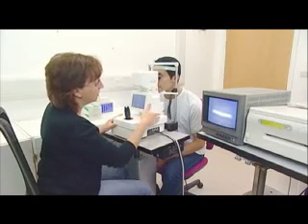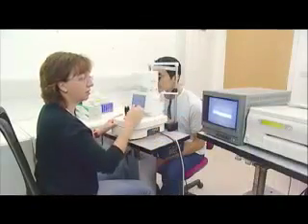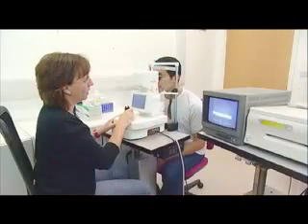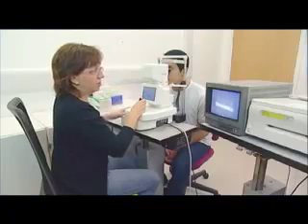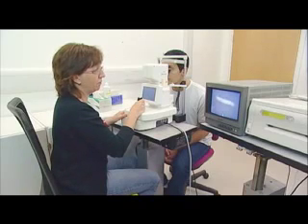It involves this unit here, this central unit — the meniscometer itself. Today, we're projecting the image onto a small TV screen, but you also have the facility to video this image, export it digitally, and indeed print the image. The information we get from the meniscometer is on this TV screen here. What the video meniscometer allows us to do is to quantify the radius of curvature of the meniscus, which in turn relates to tear film volume.